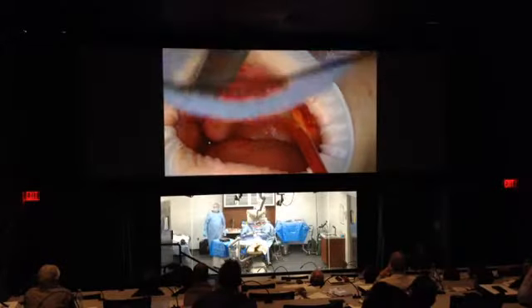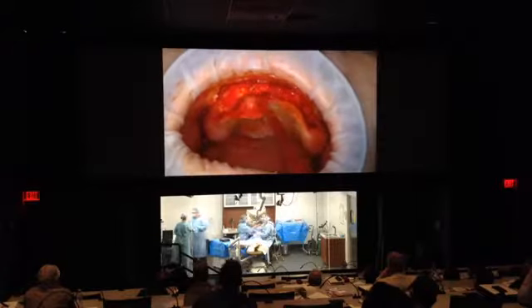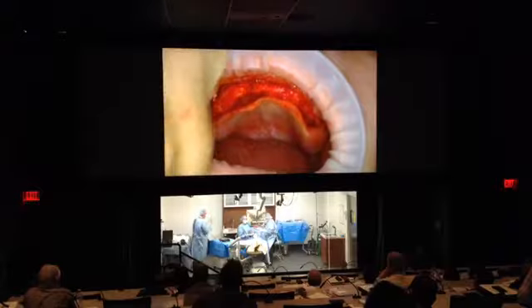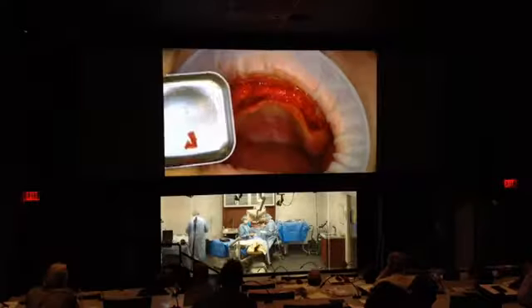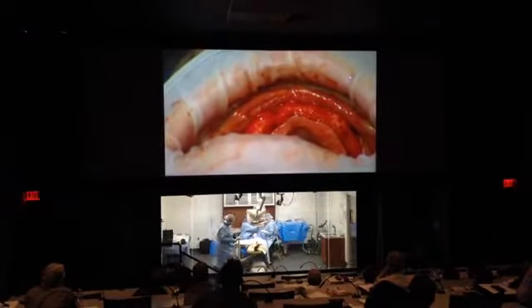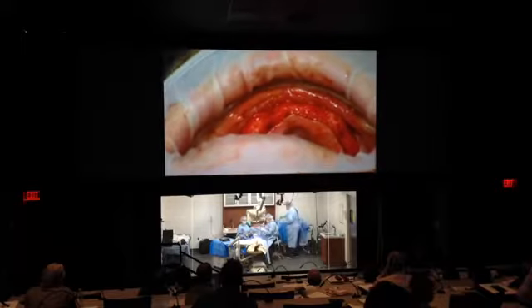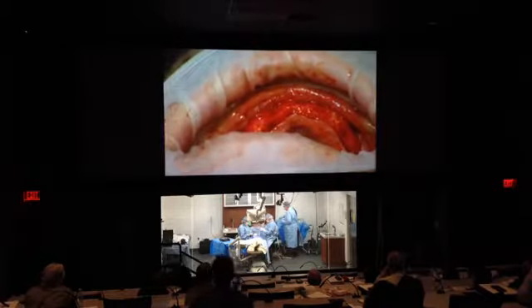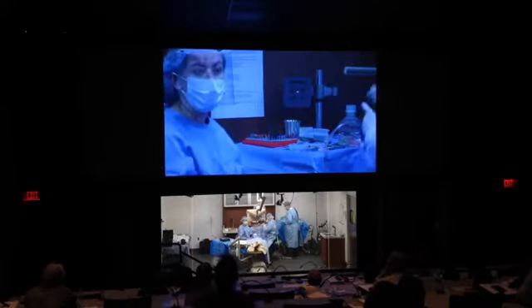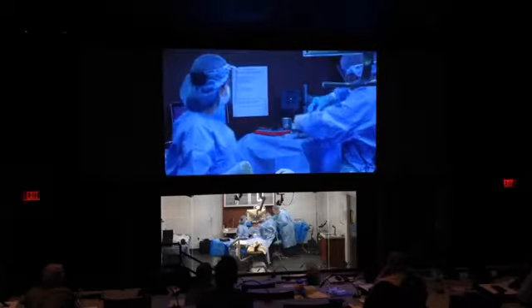Okay. So we collected a little bit of bone. I don't think we'll need it in her case. I'll show you here what we typically collect. We're going to keep it moist. If you have to graft, usually with the All-on-4 procedures, there's plenty of bone. You don't need any kind of outside bone graft. If you have a dehiscence, let's say on the anterior implant, you can always use autogenous bone, which is really the gold standard for grafting.